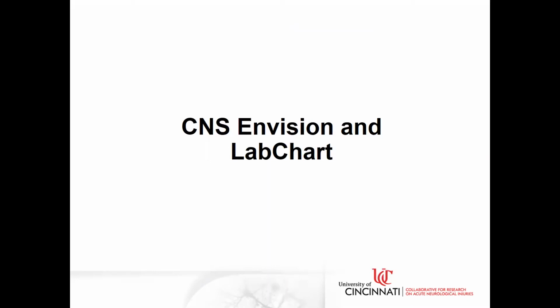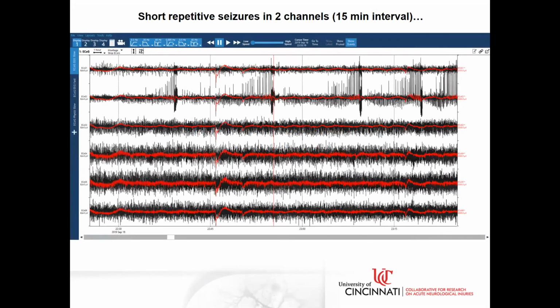And finally, I just wanted to highlight that these recordings can be reviewed offline as well. Everything I've been covering so far has been using the real-time bedside display. But you can also use the Moberg CNS Envision software, as well as software from AD Instruments called LabChart for more detailed review and scoring.